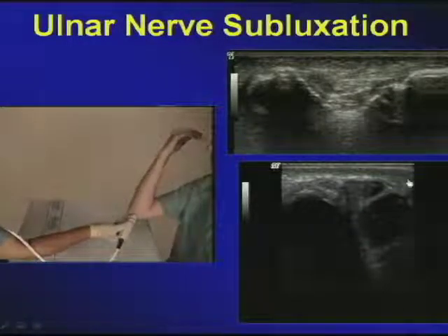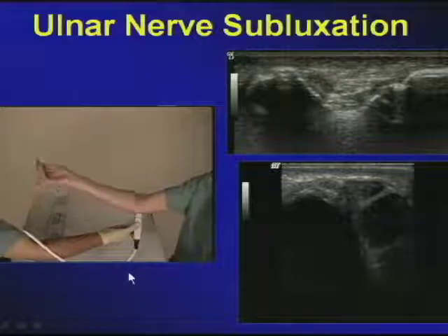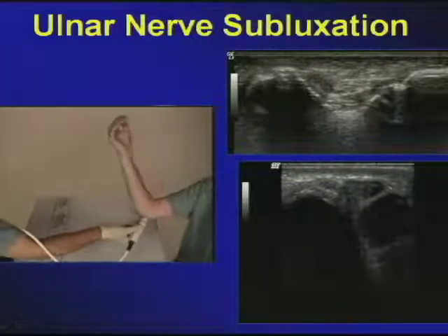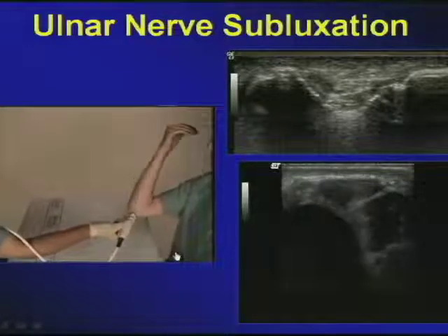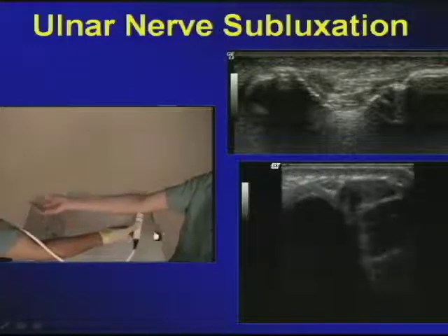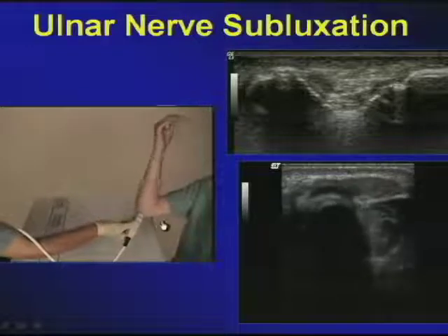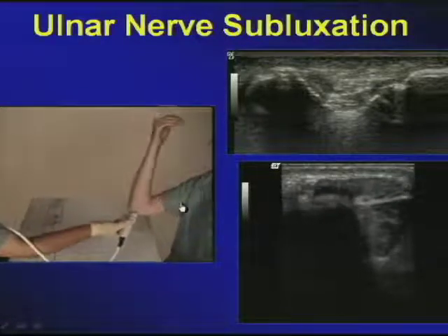One of the things that we always continue exploring is going to be ulnar nerve subluxation. Although 10 to 16% of individuals would have a normally subluxating nerve, some of them may become indeed abnormal. And the way to explore it is you want to park the elbow over the edge of the table. You might have to bolster it with some additional sheets and ask the patient to extend and flex.